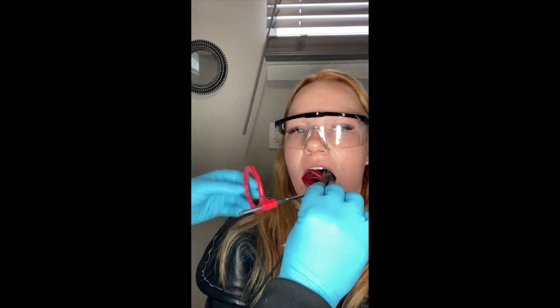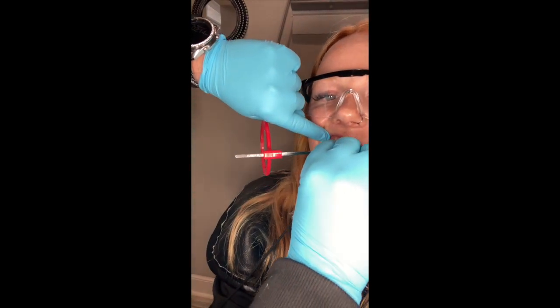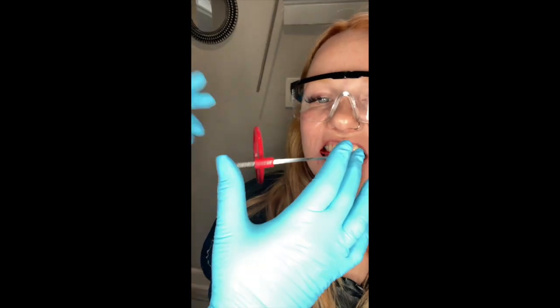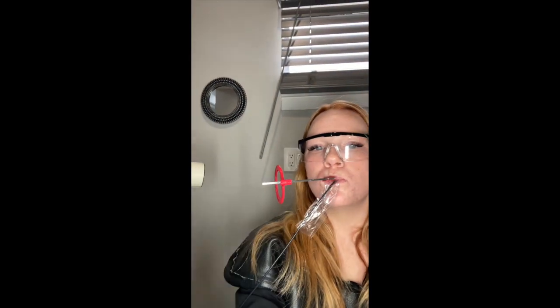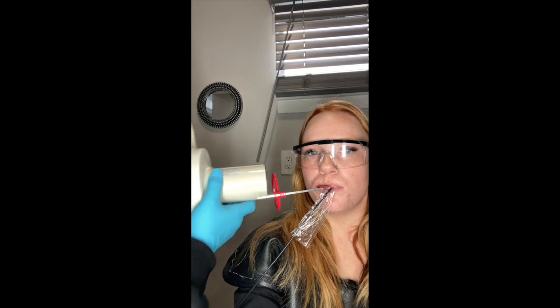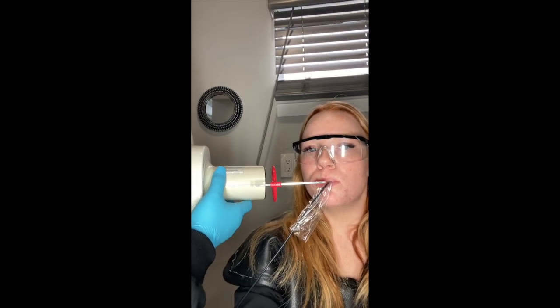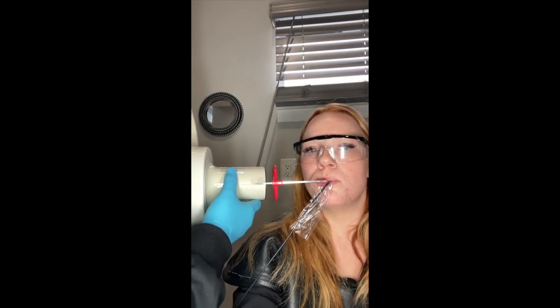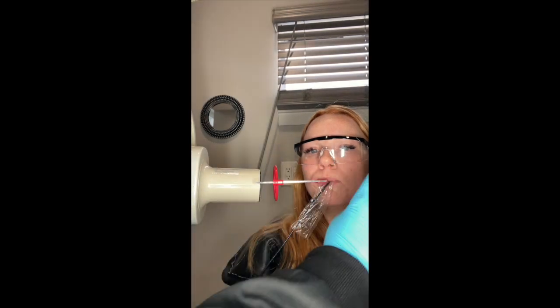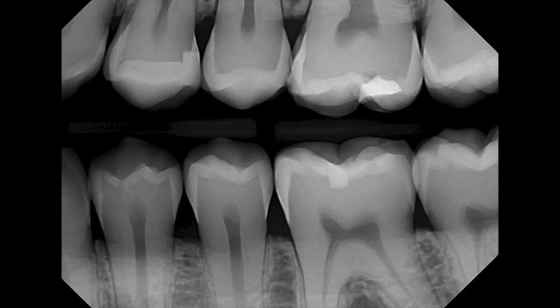I'm just going to slightly turn it. The objective of this one is to get the distal of her canine. Go ahead and bite for me. As long as you can look through your circle and you can see that you have the distal there — that would be your perfect position. You want to make sure that the head of the device is parallel with the x-ray. If it's just like that, that's what we want. Take our x-ray.